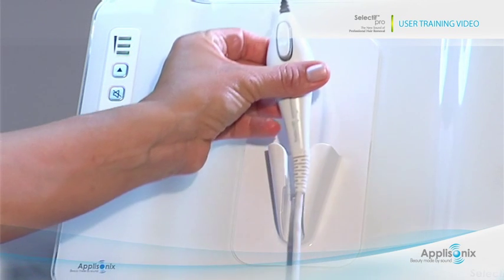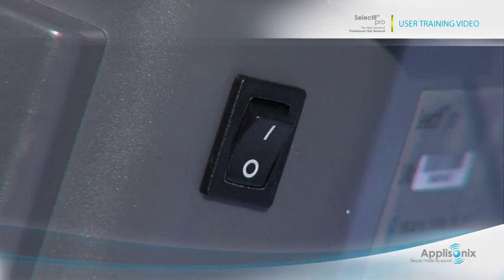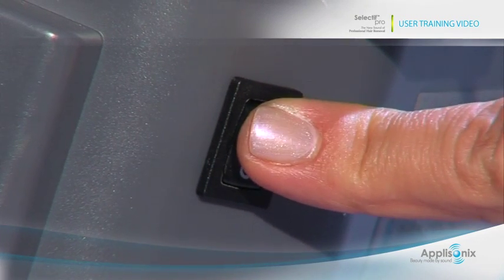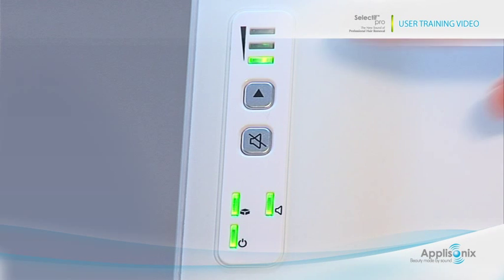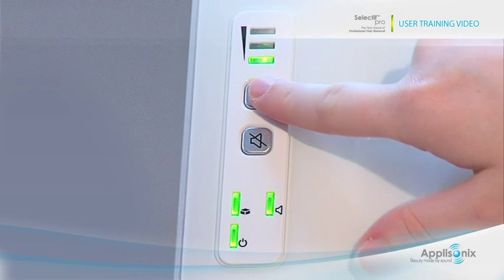Place the probe in its holder. Turn on the power switch at the back of the main unit and wait for the system to perform self-testing and calibration. The status light on the front panel will turn from orange to green when the system is ready for use. This can take up to one minute. Select the desired mode according to the body part.